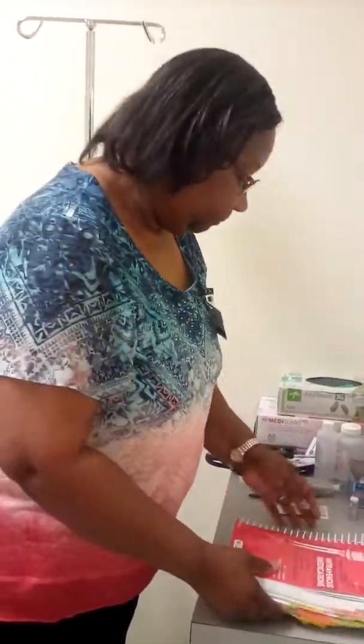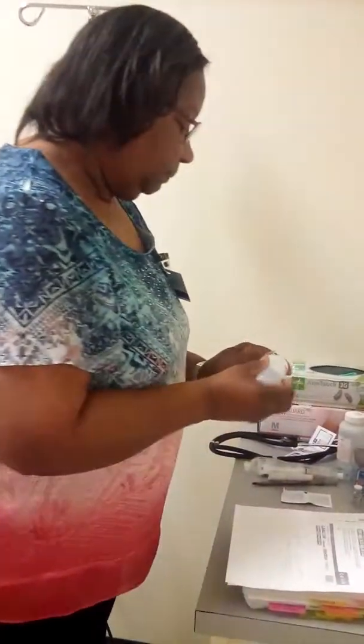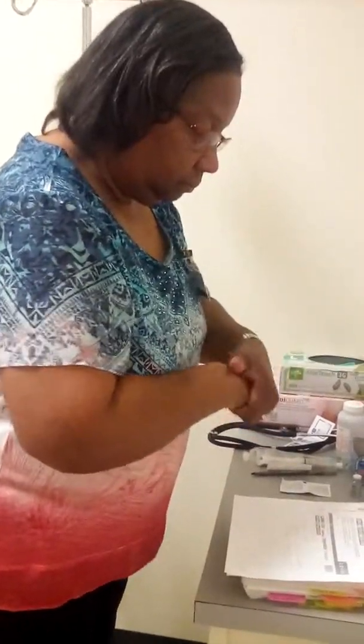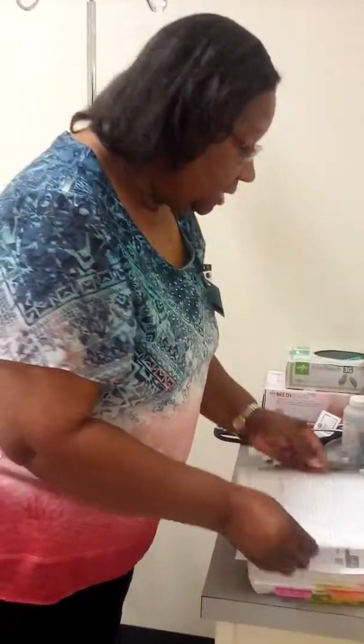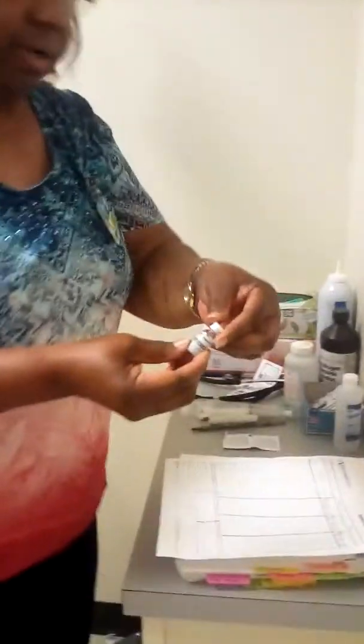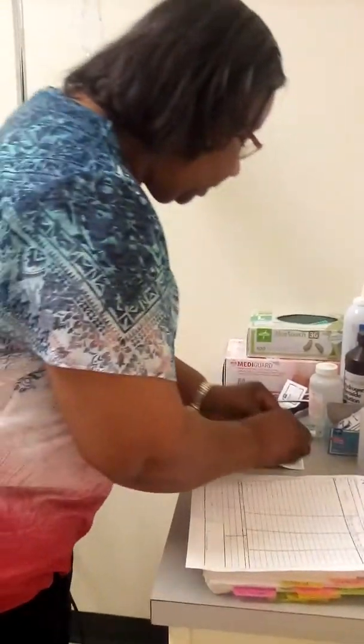And it is compatible, I said, with D5W, sterile water, and normal saline. So, I'm going to wash my hands and gather up my equipment. I'm going to verify my medicine against my MAR. I have Lanoxin here, and the expiration date is 4/20/21, and that is Lanoxin. And I'm going to give 2 milliliters.